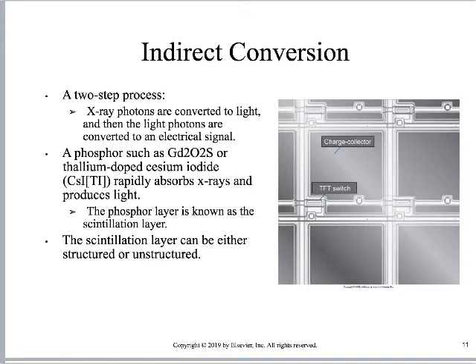So that's what gadolinium oxysulfide is. When would you need a mud puddle, right? Well, a good example would be something like combat. If I'm in a combat situation, I want a gadolinium oxysulfide detector. The military loves gadolinium oxysulfide detectors. Why? Because these things are getting dropped all the time and people are getting blown up and stuff, right? We need something that is not going to be very fragile. So it's turbid, that's the drawback.